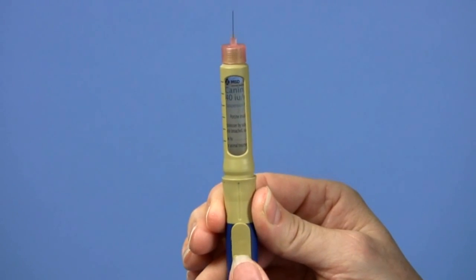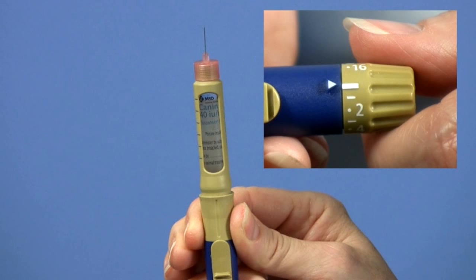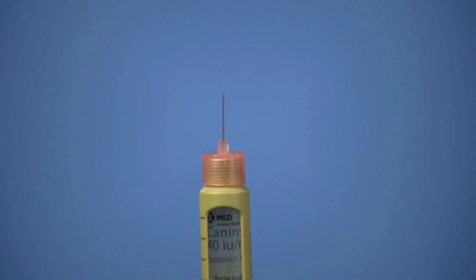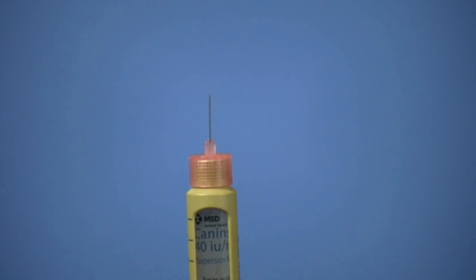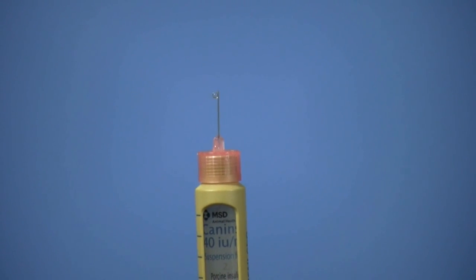Push and hold the release button towards the needle until the arrow on the pen body points to the starting line on the dose selector. Repeat these steps with VetPen pointing upwards until you do not see any air in the cartridge window and insulin comes out of the needle tip. You may need to repeat these steps a number of times. This means that VetPen is now ready for use.